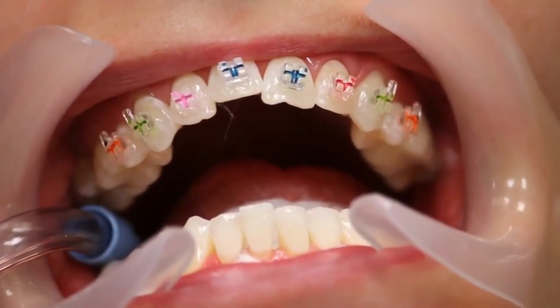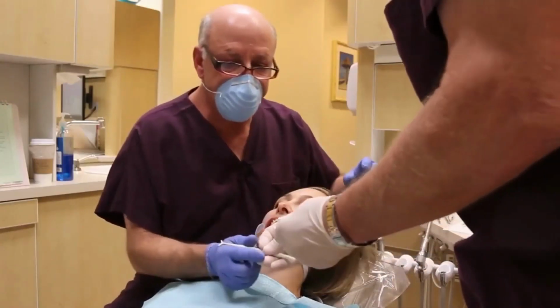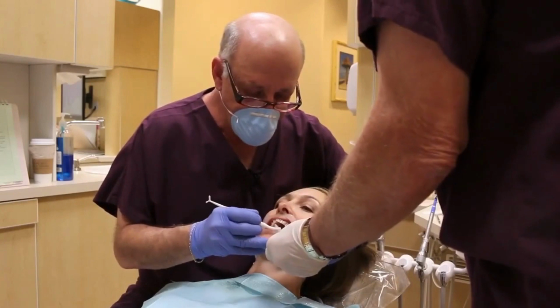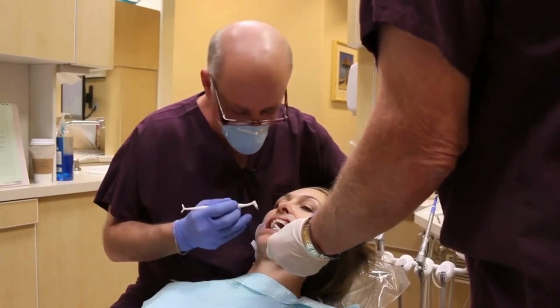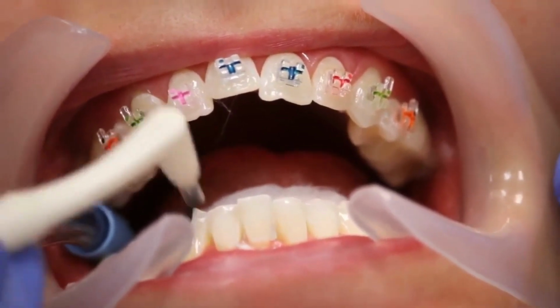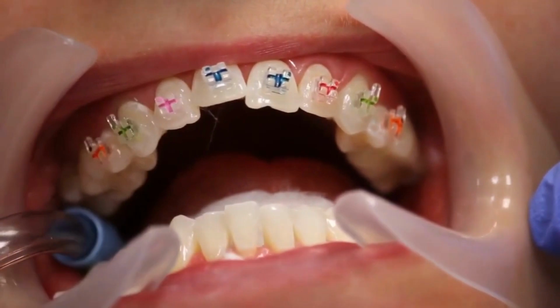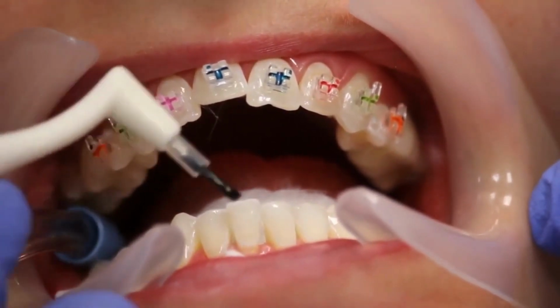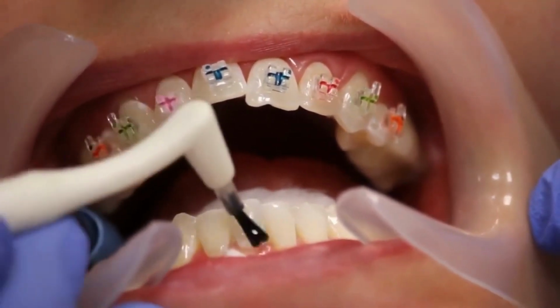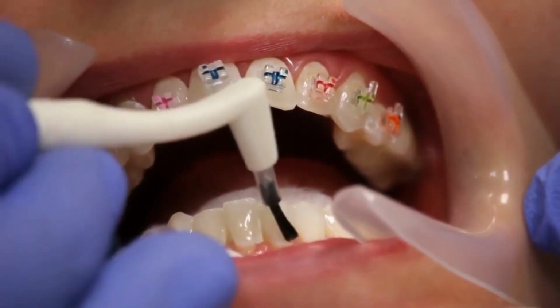Now we're ready to start the bonding process. Remember that we always start at the second bicuspids when we bond, because that is the shortest tooth in the mouth. And many a times, even though we have a pre-selected height, if the tooth is too short, we may have to make adjustments to that height.